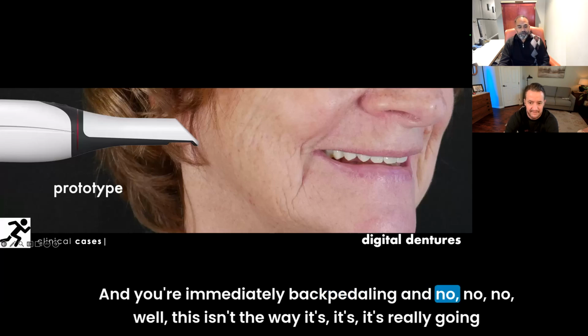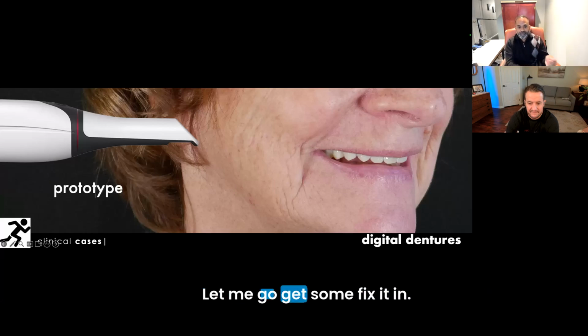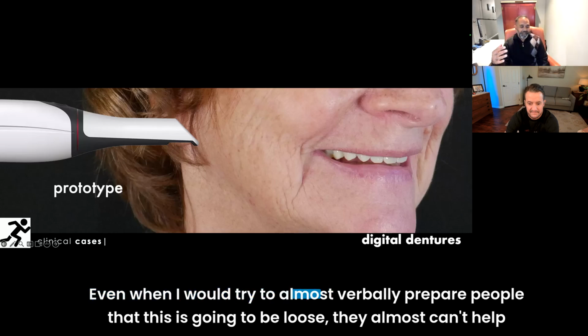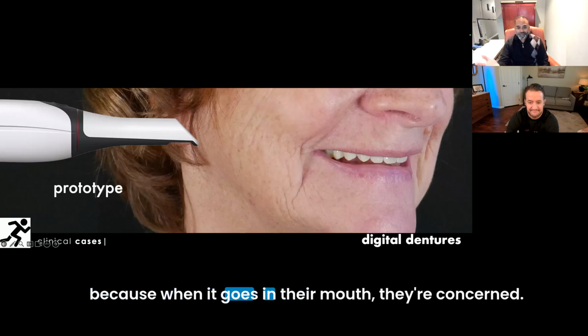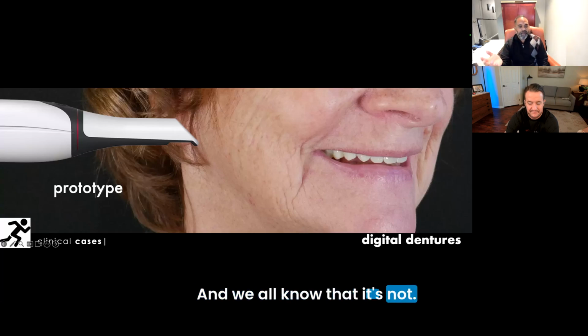And no, well, this isn't the way it's really going to fit. We're just looking at the shape of the teeth. Here, let me go get some Fixodent. I'll put this in. Oh, am I going to need to use Fixodent on the new ones? Even when I would try to almost verbally prepare people that this is going to be loose, they almost can't help it, because when it goes in their mouth, they're concerned. It's just, oh my gosh, is this what it's going to be like? And we all know that it's not.